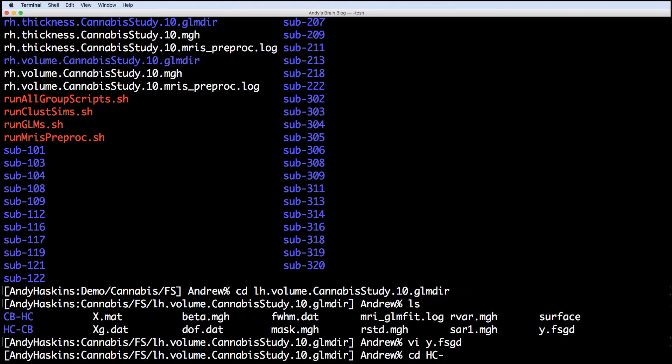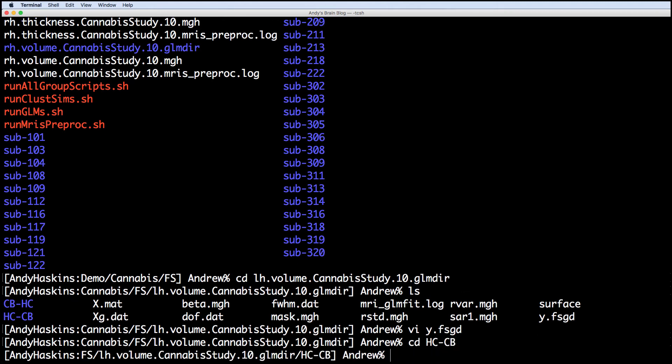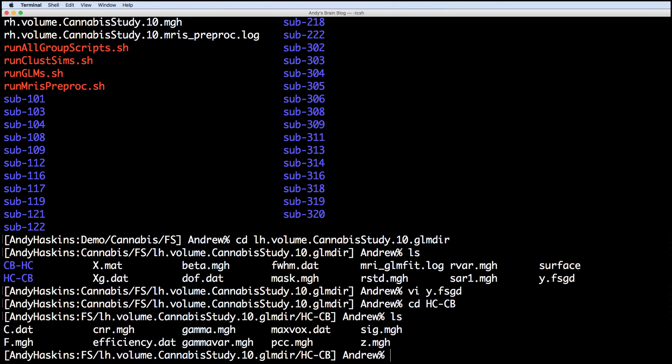Within the contrast directories, we have mgh files, which are statistical maps. The sig.mgh file contains the significance at each vertex, while the z.mgh file contains transformed z-scores, pcc.mgh contains correlation coefficients, and gamma.mgh contains effect sizes.